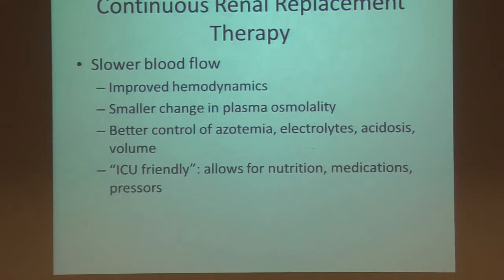You get pretty good control with azotemia, electrolytes, and acidosis. The only thing here, again, with this sodium is when you are using an actual CRRT machine with a prepackaged bag, they have a fixed amount of sodium, so those patients you have to be a little bit more careful with. Whereas in a regular dialysis machine, you can adjust the sodium for what you want. And it's ICU friendly in one way. It's hard on the staff the other way.